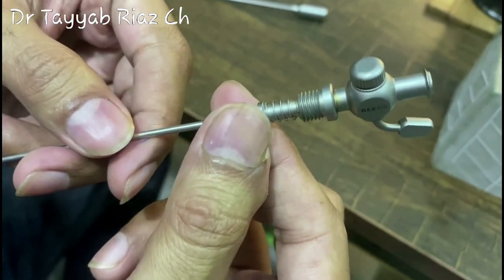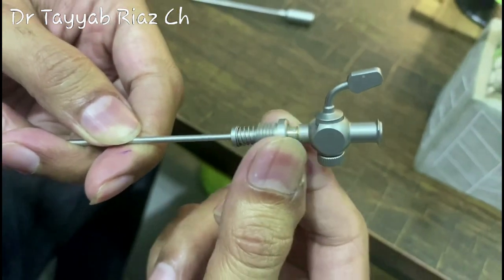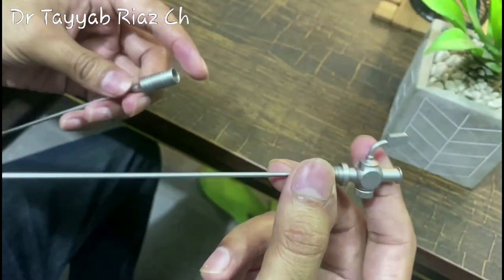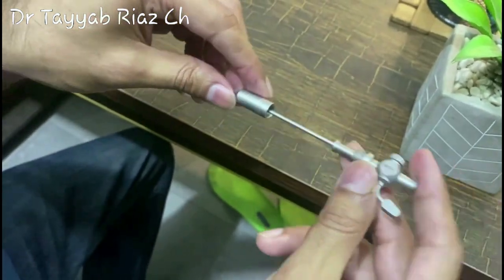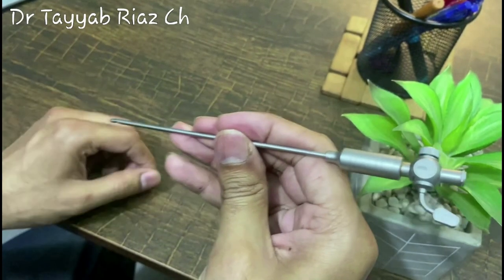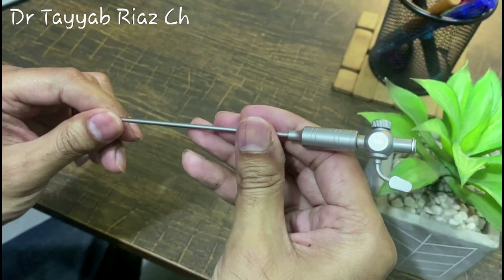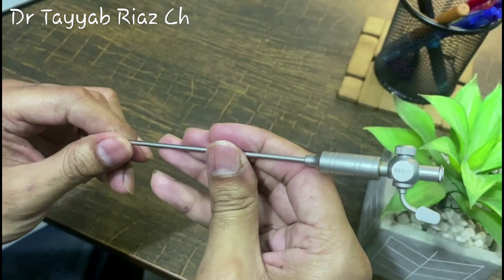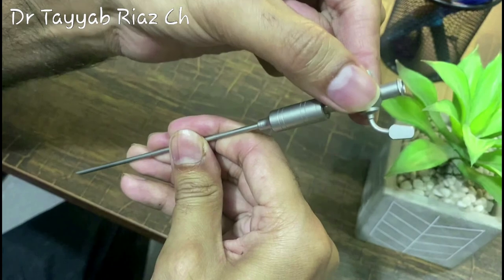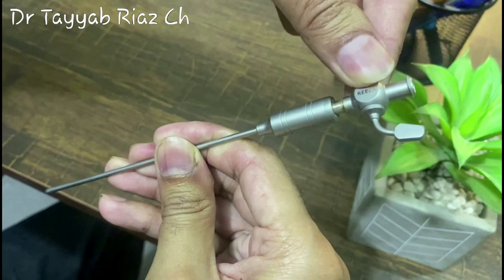There is another safety component of this needle, and that is this spring mechanism. It prevents the accidental or inadvertent injury of the intra-abdominal structures or organs when the needle passes across the peritoneum. And for this spring mechanism to work, it is necessary to hold the needle but not the stylet. Like if you hold it here, then this spring mechanism will work and it will be lifted up like this.